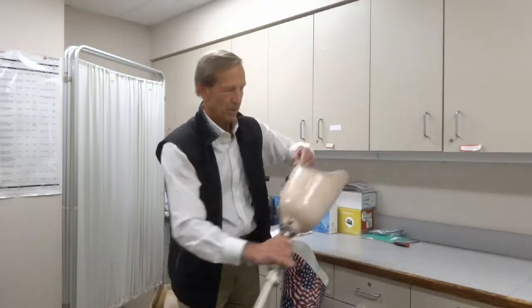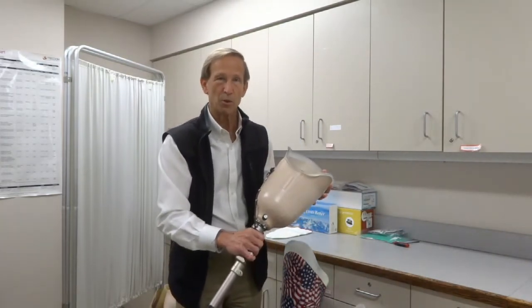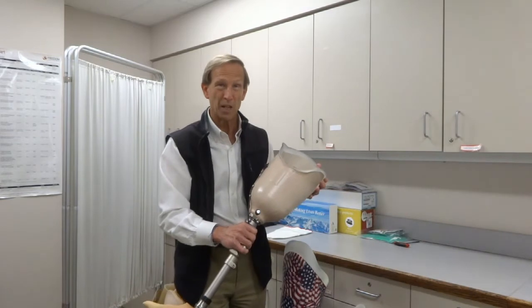All sockets are made from a casting or molding of your leg. The prosthetist would use fiberglass or some kind of electronic scanner to duplicate the mold of your leg, and then from that mold, build the socket. The socket is the top piece here — it's custom molded to the shape of your residual limb or amputation limb.